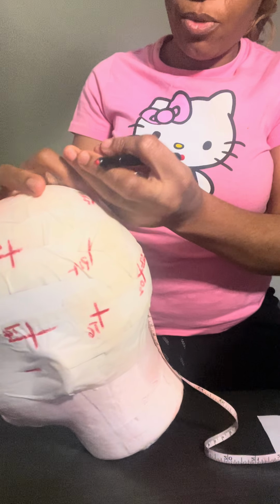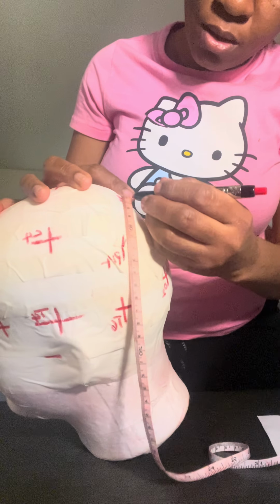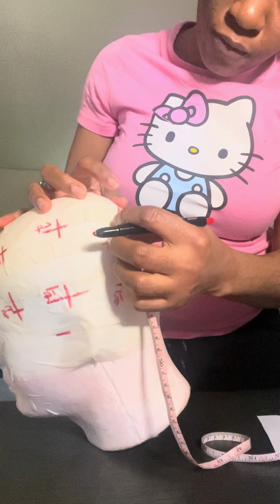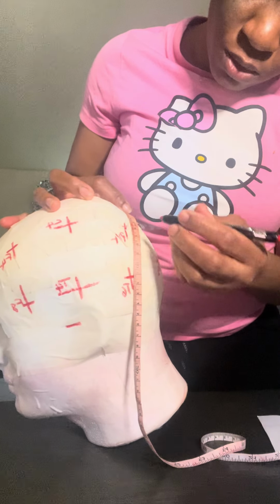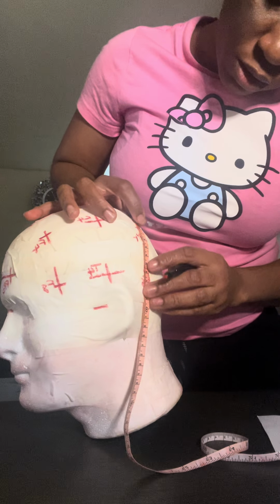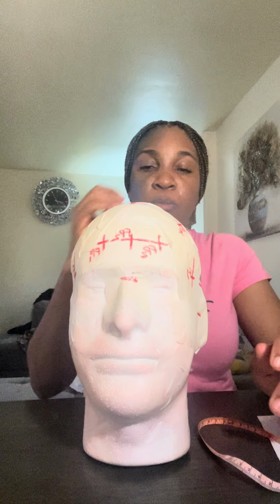From my true P3 going 5.7 is going to give me my true PZ. Okay, from my true PZ, going 5.7, it's going to give me my true P4. So from my true P4, you take the tape, 5.7. So I'm done with my measurement.